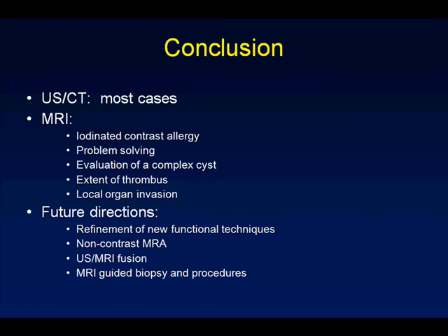As mentioned, ultrasound MR fusion to aid in prostate cancer diagnosis and treatment. MRI-guided biopsy, it's out there, but it takes about an hour and a half to do a whole biopsy. So that's why ultrasound MR fusion is probably a more feasible and practical approach. But people are still at it, still trying to cut down their MRI biopsy time and looking at ways to do MR-guided focal ablation.